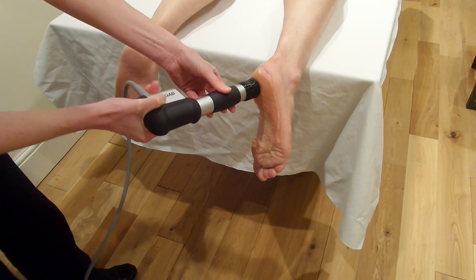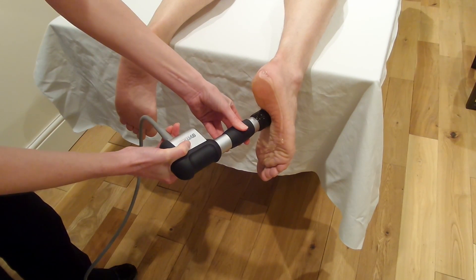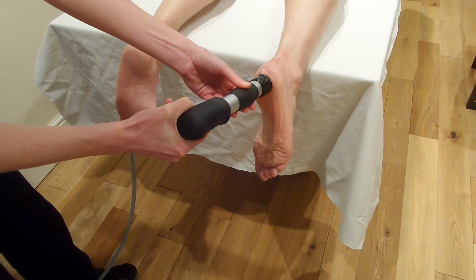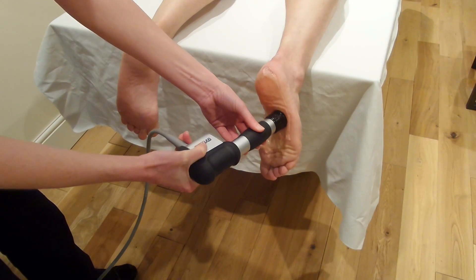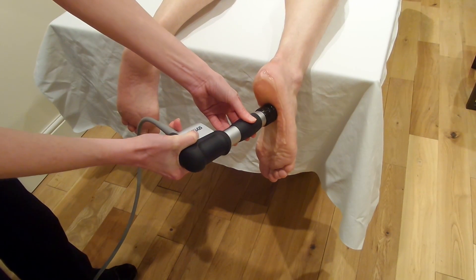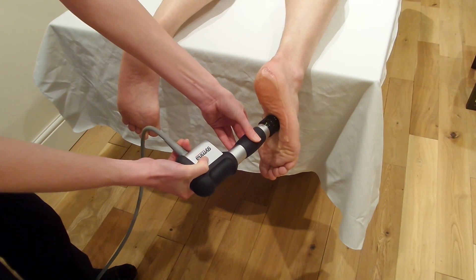You can probably see here the patient curling his toes and moving — that's the pain of the treatment. It is quite an uncomfortable treatment. Even though it's at a faster frequency and not a particularly high power level, it's still quite uncomfortable. You will see the patient squirming around on the bed and may find it difficult to keep the foot in the right position.